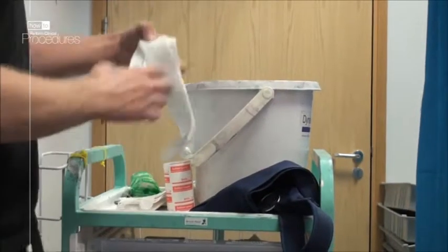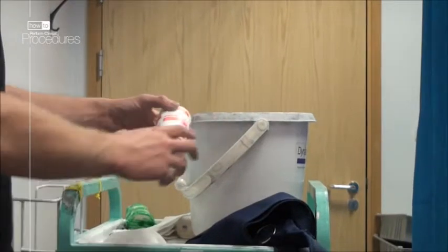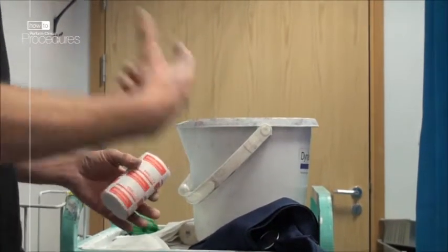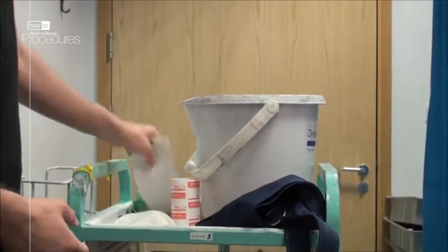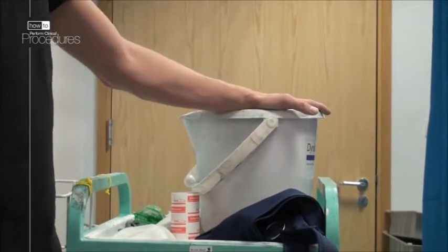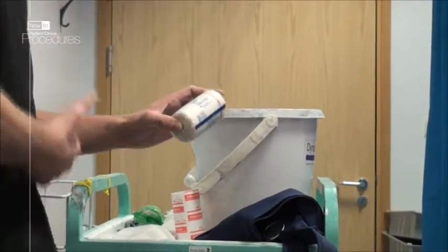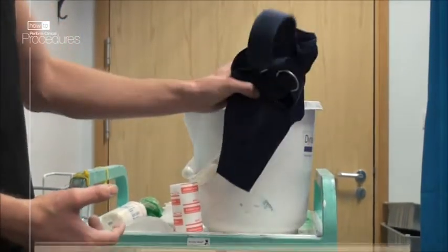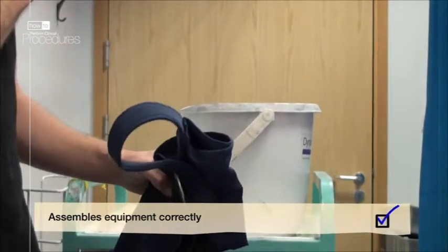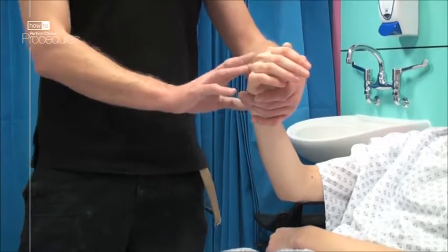You'll need the following: stockinette to protect the patient's skin, undercast padding so that it is nice and comfortable for the patient, the plaster of Paris itself, some tepid water at room temperature, a crepe bandage for the final layer, and finally a high arm sling to assist with elevation and optimize the patient's comfort.